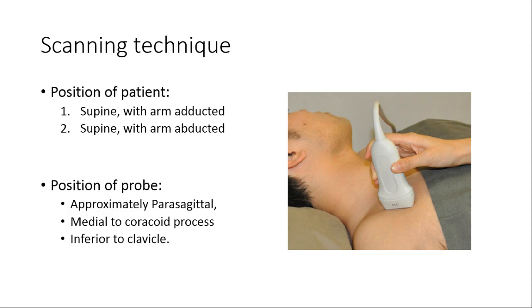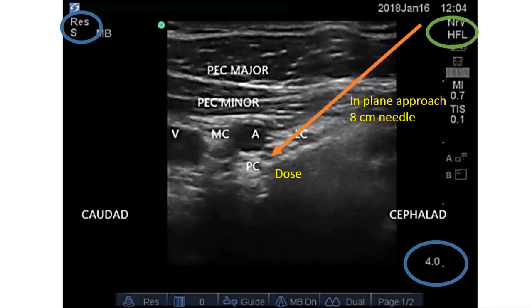Scanning is mostly done in the supine position with the arm adducted or abducted. The probe is placed in a parasagittal orientation just inferior to the clavicle and medial to the coracoid process. A high-frequency linear probe in resolution mode is used, with depth set at four to five centimeters. An eight-centimeter short-bevel needle is inserted in-plane from cephalad to caudal, just inferior to the clavicle. Dose is 25 to 35 ml of local anesthetic.